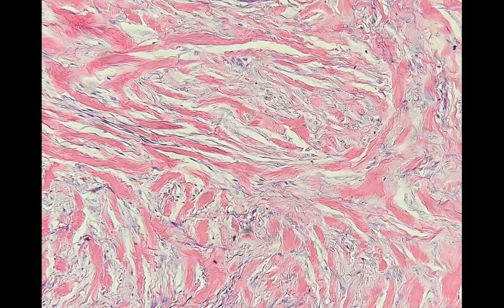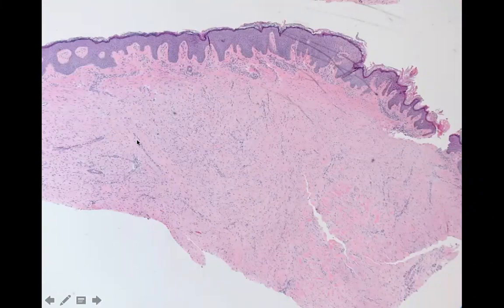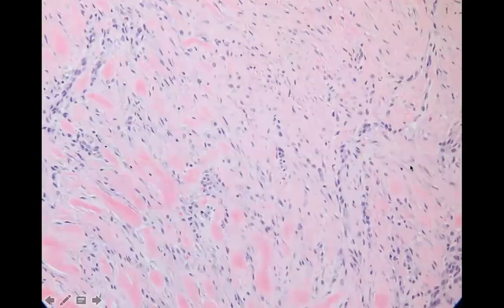Here's an up close on the ropey collagen bundles. Here again, this is all hypertrophic scar. So you can see that you have horizontal areas, squished little vertical vessels, and you've wrapped it so they're going all in different directions when you cut it and look at it two-dimensionally. And then here in this section, you can see these pink ropey collagen bundles. If I only got this, I would call it hypertrophic scar. As soon as you see this, you call it keloid, okay?